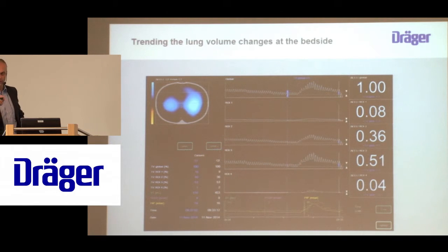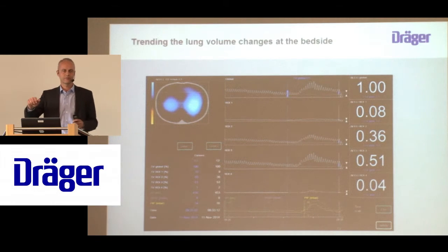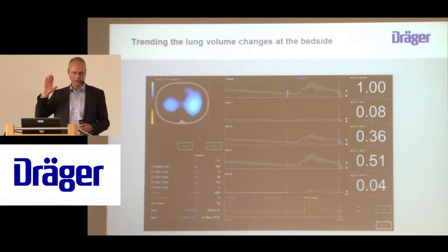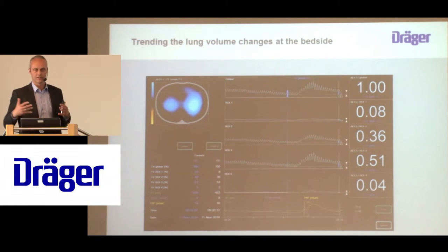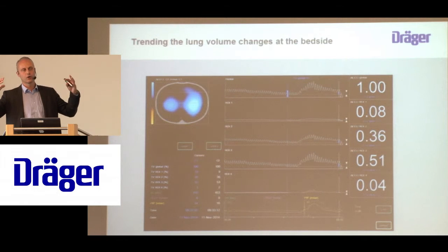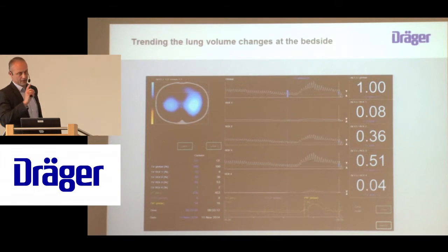Then, because I've said we are focusing on lung volume changes. The one change is typically when ventilation is taking place, that is changing the lung volume, what we know as tidal volume. But the second one is when, for example, we increase the PEEP, we increase the force that keeps more air inside the lung, and then we always have an increase of lung volume, but we don't know where exactly this increase will happen. Maybe we just further overinflate lung tissue that is already ventilated, or we have real recruitment of collapsed parts. And so we can display these kind of offsets in the curves.